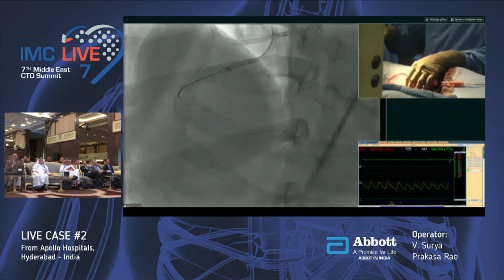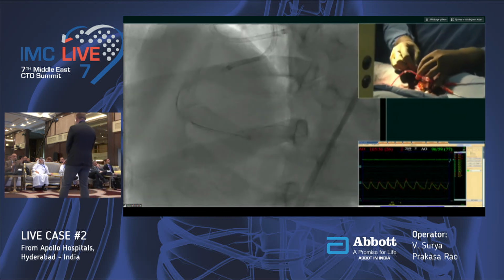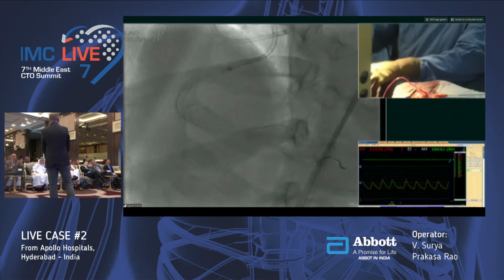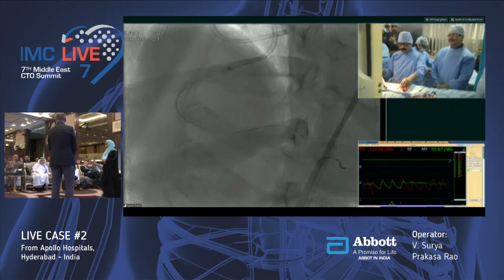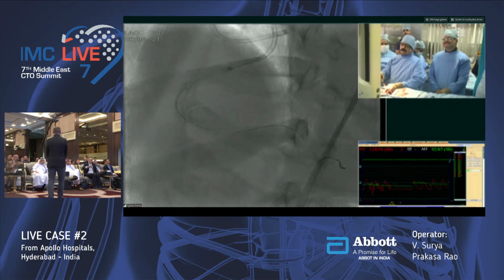What about going back to the PDA and post dilating with a larger balloon? We did already. We have done it already. Now I'll give a final injection here. Okay. Another thing, you can use a 0.6 balloon. 3.5. But Sapphire 1.0 is a good one already.